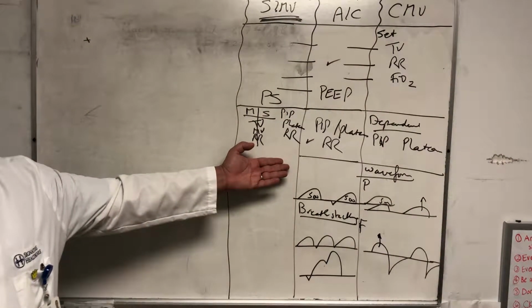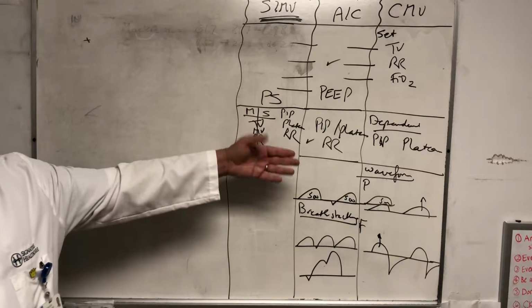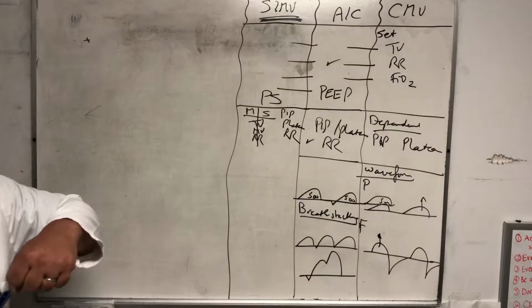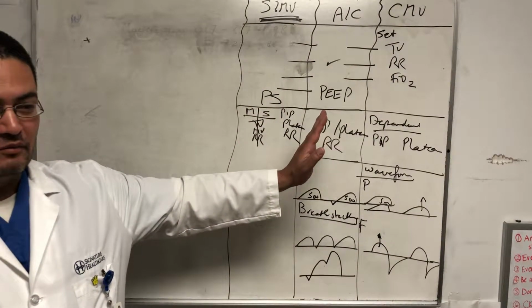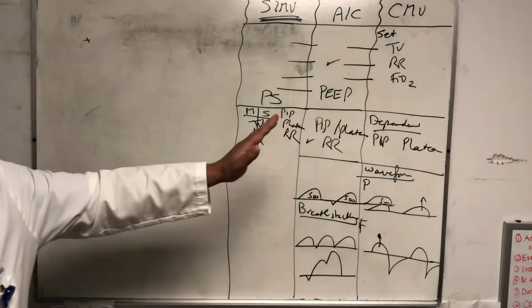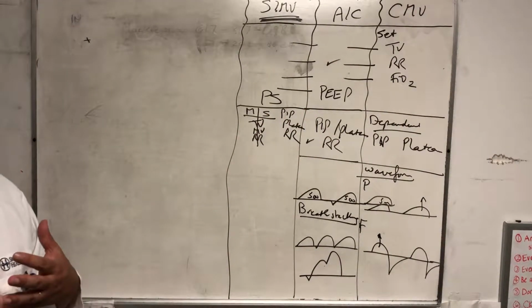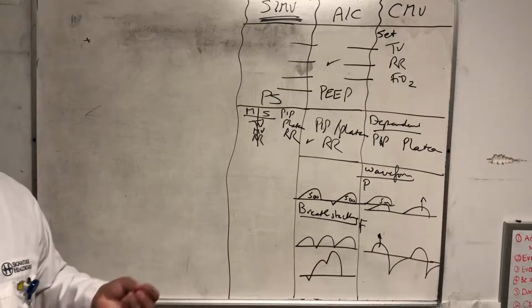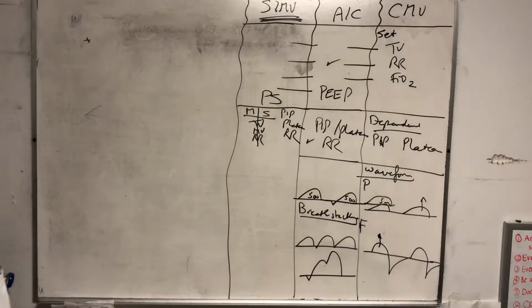In the 90s, vents advanced enough that we now have feedback from the patient. Before that, we didn't have any feedback from the patient, right? And feedback from the patient is very, very important because once you see what's happening inside the patient, you can actually make some adjustments. We didn't have that capability before. In the 90s, we had some.